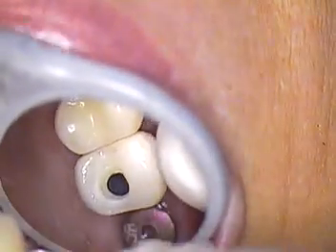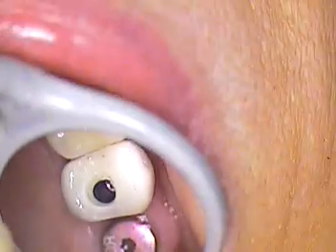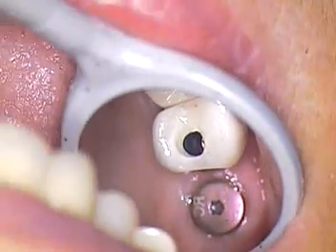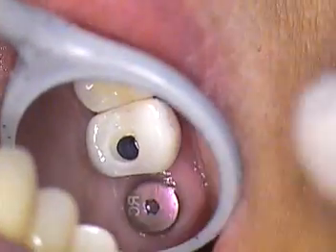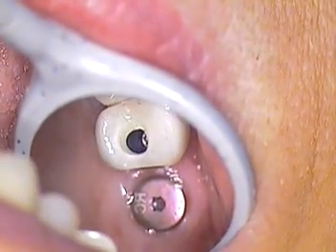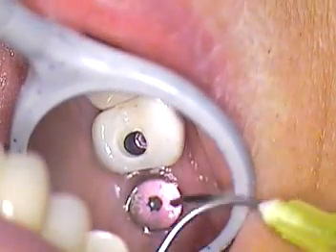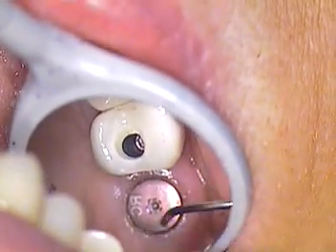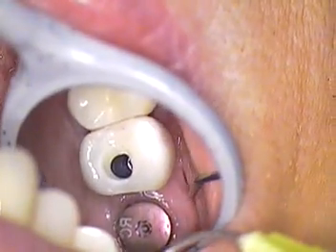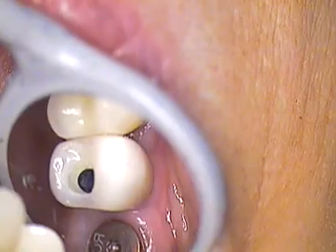There was a huge history about this case. There was a huge abscess up in the sinus wall, and the surgeon had to graft that site. I believe it was quite intense. So he did graft the site and got us to this point with the two implants. I believe the soft tissue attachment looks quite adequate.